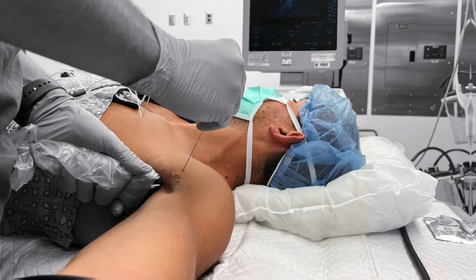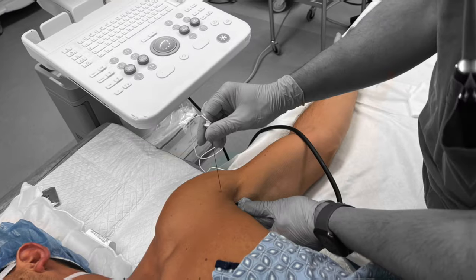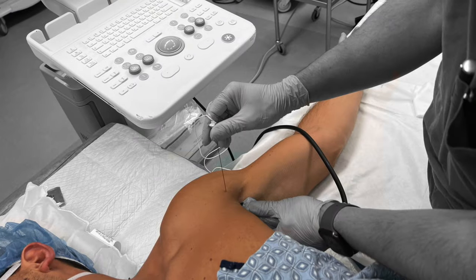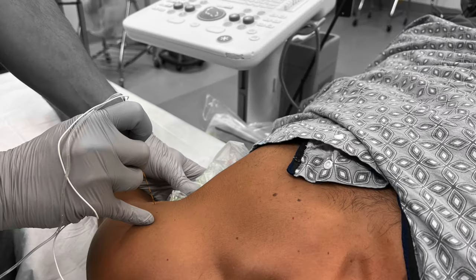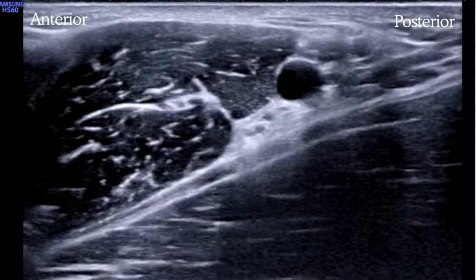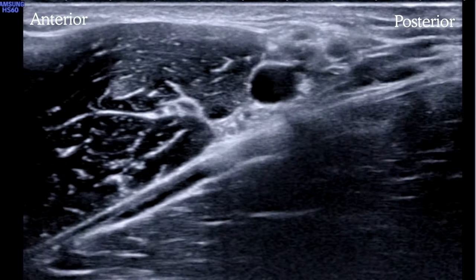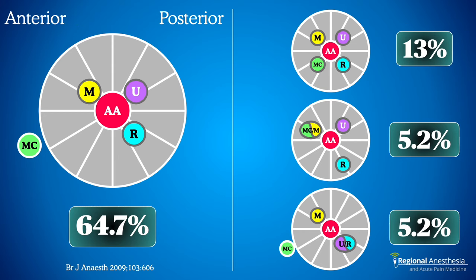The patient should be supine with their head turned away and the arm abducted to 90 degrees and externally rotated. This block is easily performed from several angles — really comes down to personal preference and ergonomics. The transducer should be positioned transversely on the medial arm and moved proximally until it runs into the pec major muscle. Your main sonographic landmark is the axillary artery, which you can see pulsating.